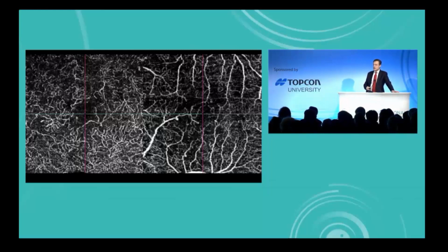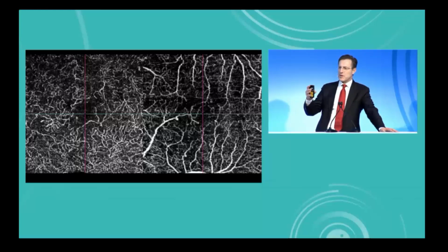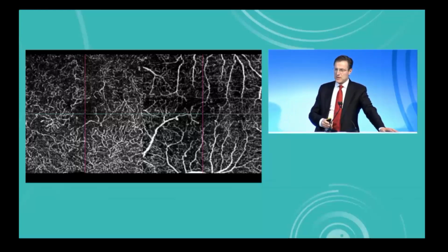in different ways, and this is a whole new field of research that is opening, because previously, in a research project, you may have done repeated fluorescein angiograms on a rare patient, but there was an ethical and logistic boundary to how often you can follow a given capillary. Now you can do an OCT angiogram and follow every single capillary from month to month, from year to year in your patients with diabetes.